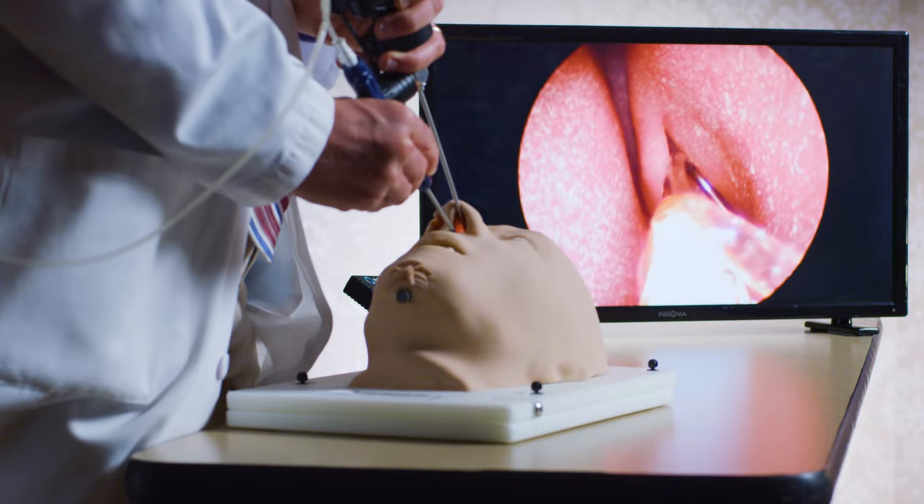Most of the sinus procedures that we perform can be done in the office or the operating room, and they use just different tools. One unique option is what's called a balloon sinuplasty — a procedure where there's no removal of tissue in the nose or the sinuses.